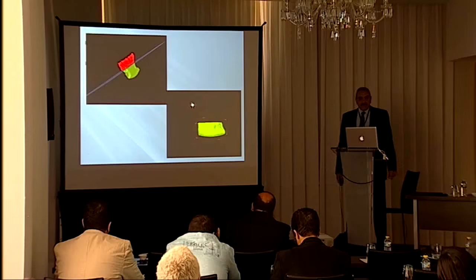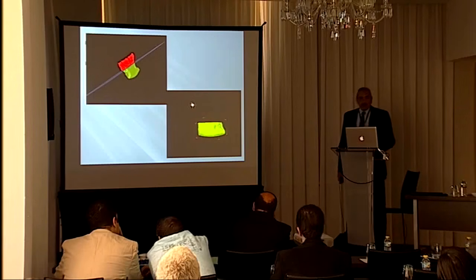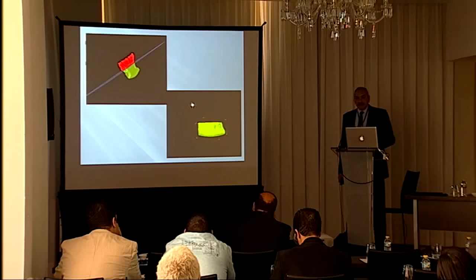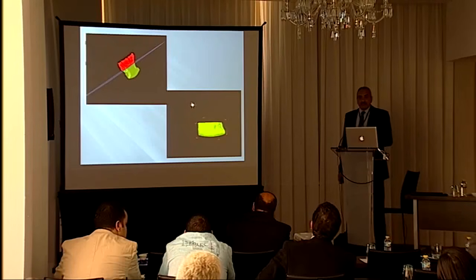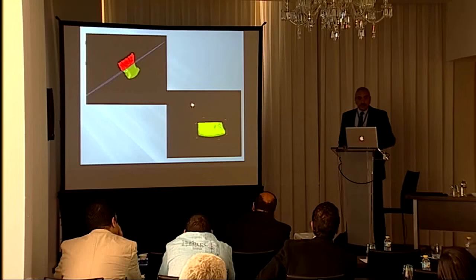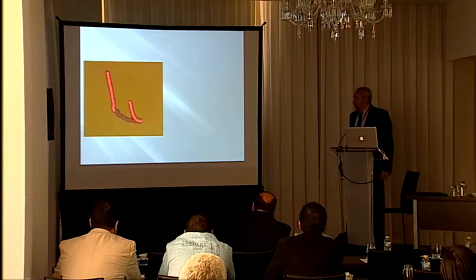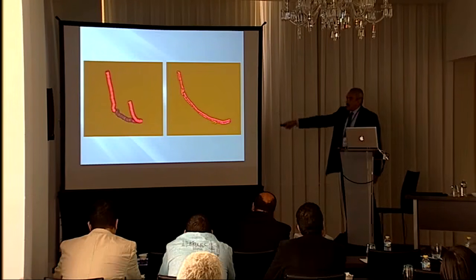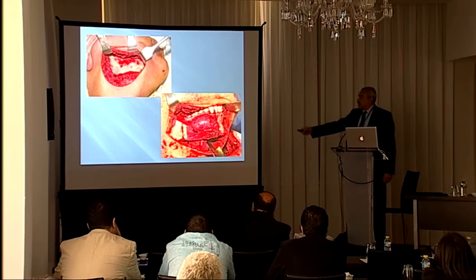We use the SCPC, which is the silica calcium phosphate ceramics with nanopores, and we add BMP and bone marrow extract on it, so we do the resection, place this in place, and fix it with the reconstruction plate and close, and we finish the reconstruction in one go. This didn't work out very well. We're still studying that. This is the resection template, and this is the reconstruction plate template, and that is the surgical cases.